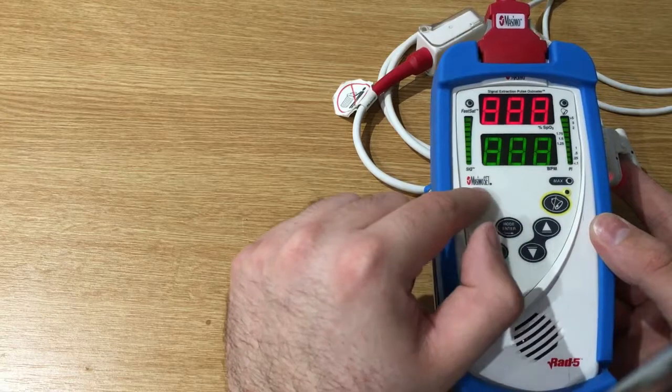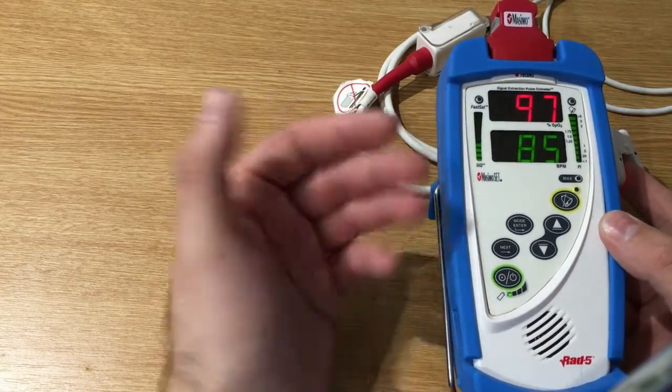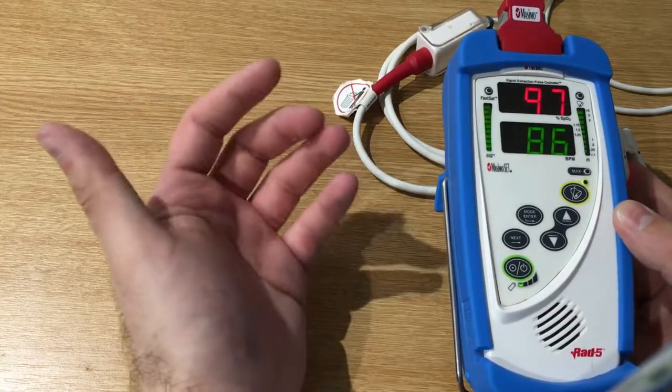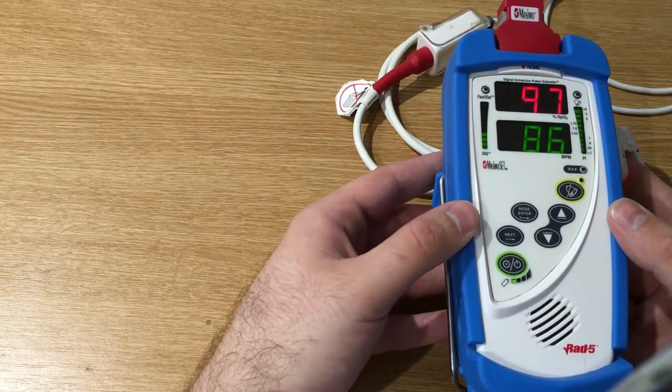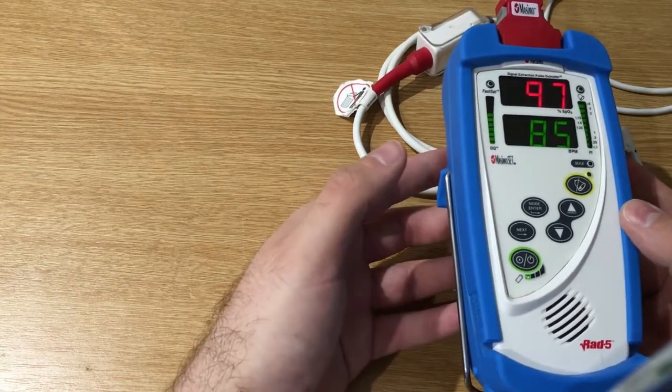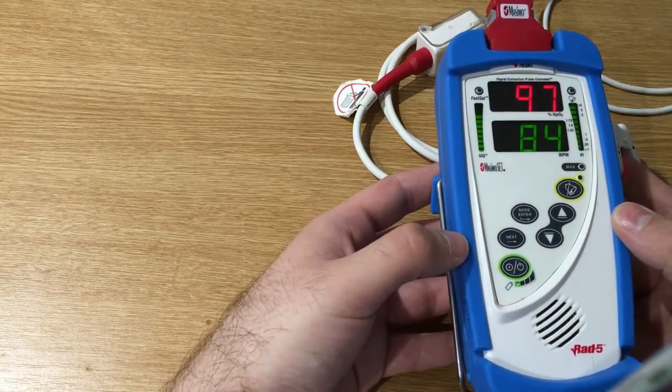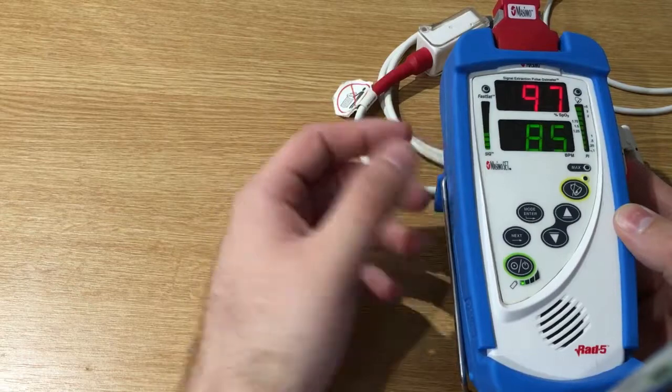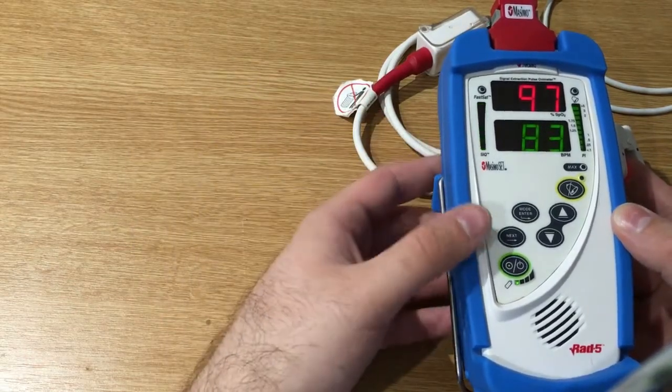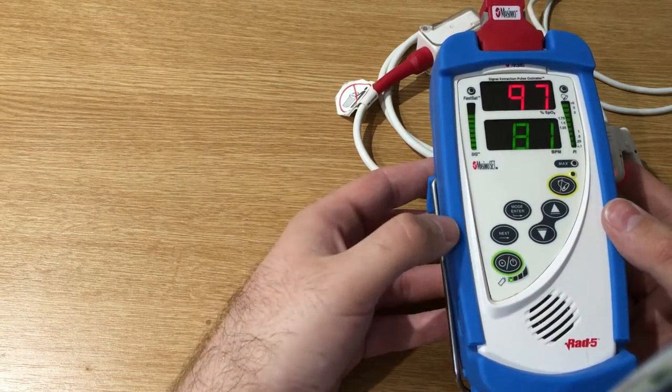Here, as you can see, there is the Masimo Signal Extraction Technology logo. The Signal Extraction Technology uses five parallel algorithms for SP02 calculation. Most pulse oximeters assume that the arterial blood is the only one that's moving, whereas this pulse oximeter with the SET technology can cancel the noise produced by the venous blood in order to give an accurate pulse rate and SP02 reading, even if the patient is moving.